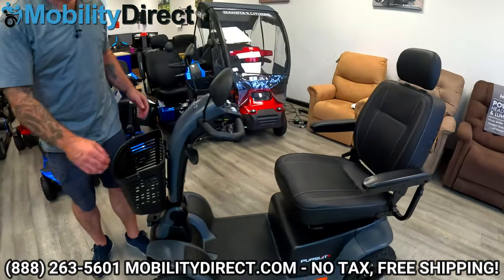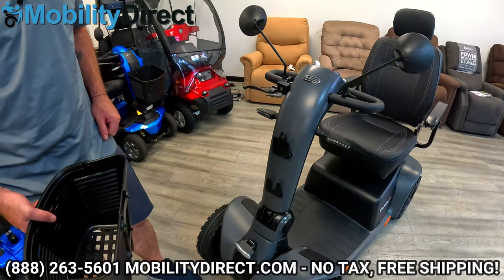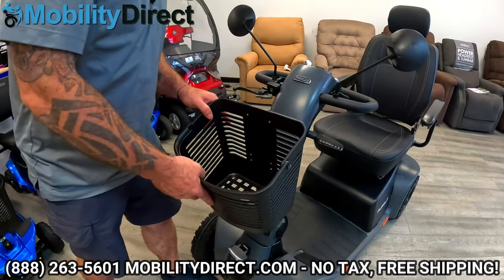Here's your front basket — it can also be removed by pressing on this tab and lifting up. Let me just put it back on.